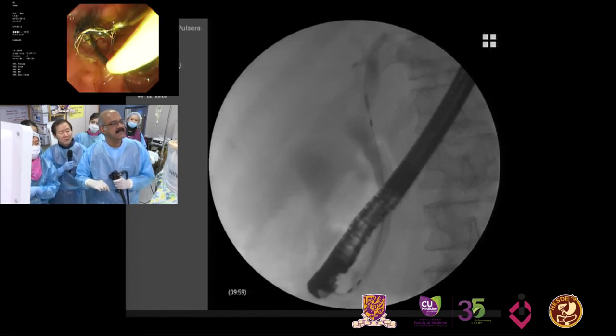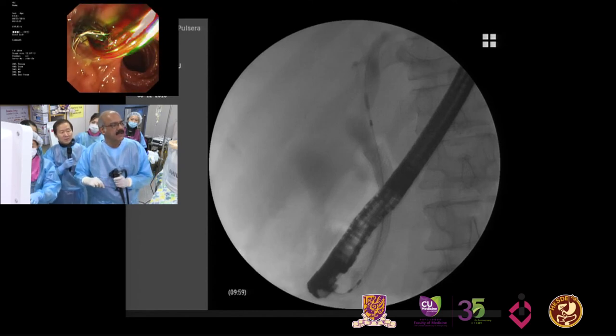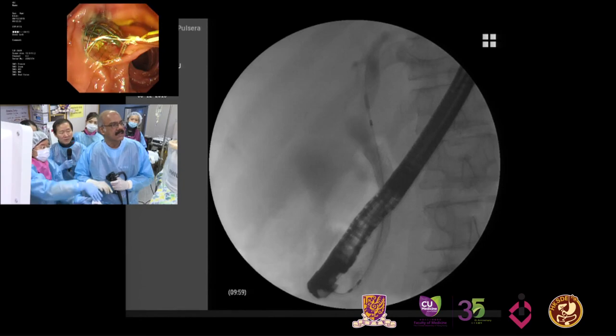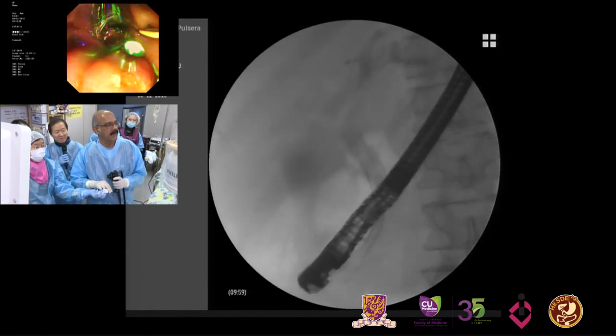This lasso will help us to pull out the stent if we want to, but this is partially covered. After 4 weeks, it'll be difficult to do that. Before that, you can adjust the stent. I think this is nicely put in. Very beautiful. Thank you.